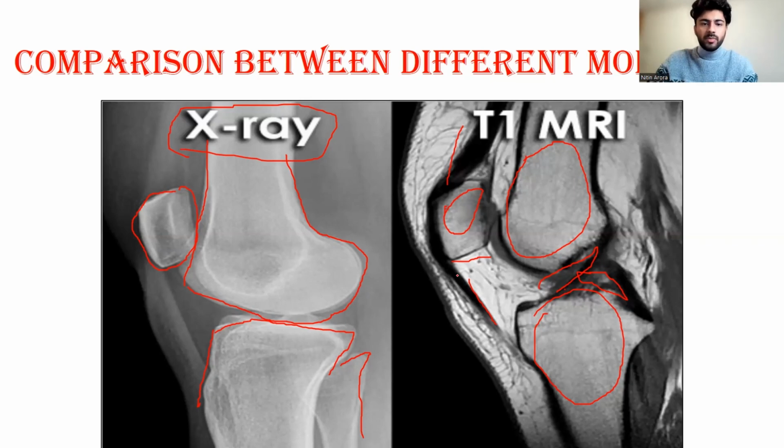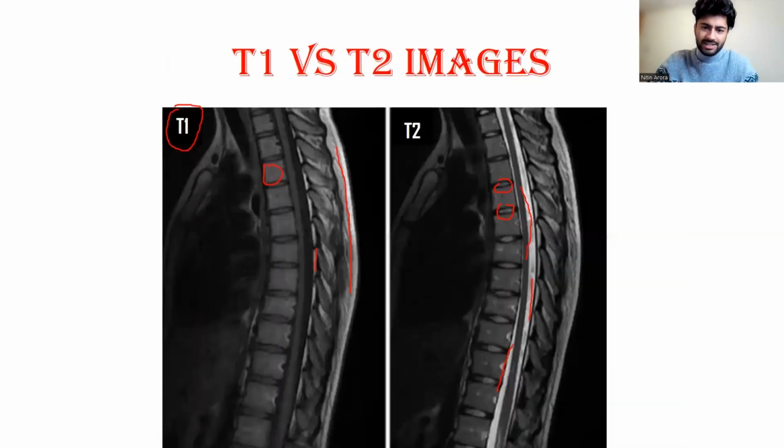Okay. Now, last but not the least, what you need to take care of is that whenever you see an X-ray or an MRI scan, you need to see which type of image it is.